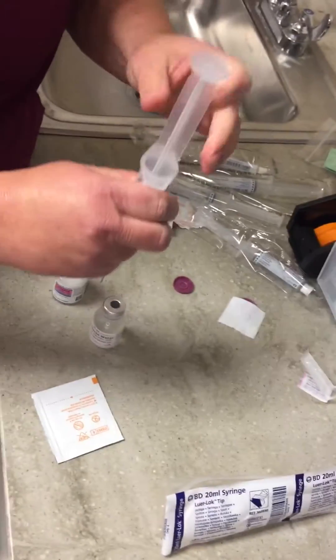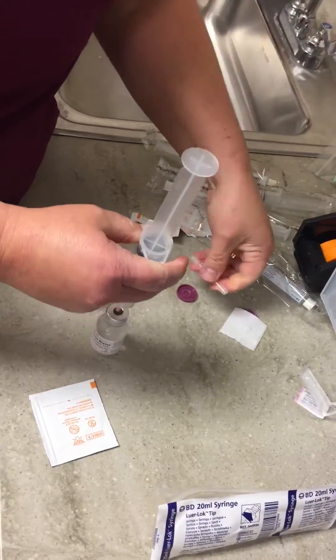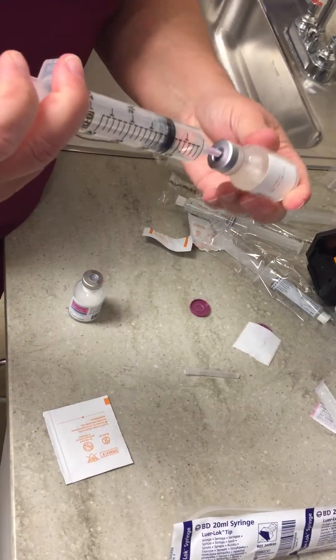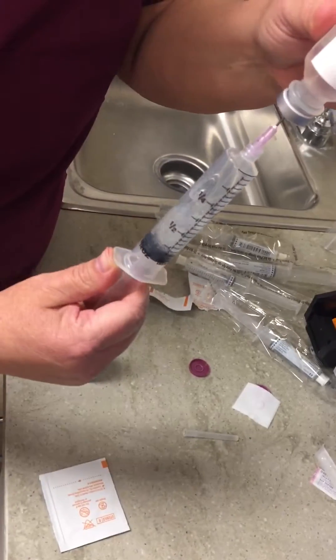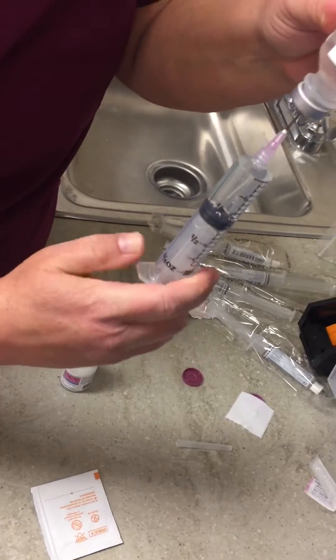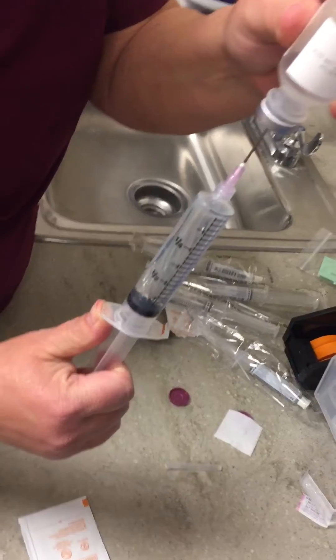I'm taking a little bit more air in my syringe than what I need, then push as much into the vial as I can, draw out as much as I can, then push the rest in and draw out the rest.